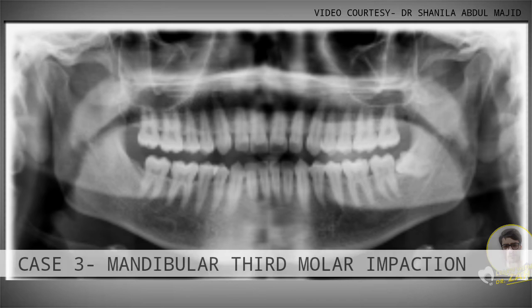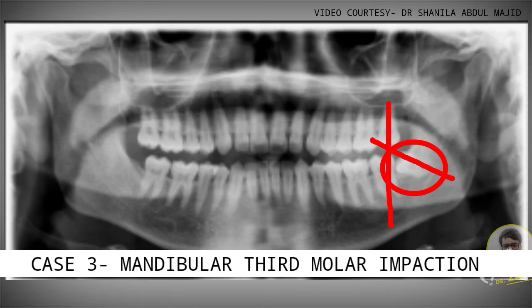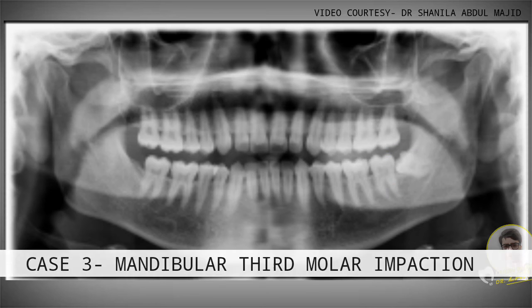The next case scenario is a mandibular third molar impaction in the region of 38, where the long axis of 38 is found to be more perpendicular when compared to the long axis of 37. This can be considered a horizontal impaction in relation to 38.